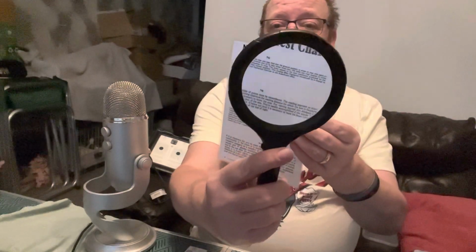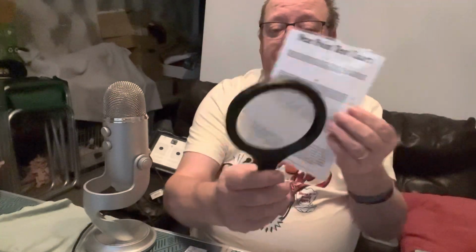Now I've got here two different magnifiers. Both of them are 2x magnification, but the difference is that this one is a glass lens and it's not illuminated. The other one is illuminated, so this would actually help to light up your page, whereas the glass one would be a magnifier. You can see that it does magnify quite well. It's 2x magnification. This one is also 2x magnification, but this time it's illuminated. So if there isn't very good lighting, you'll find that this one will help you more.